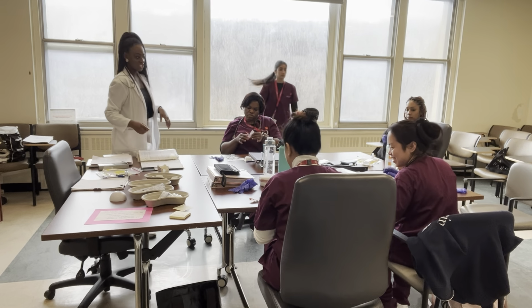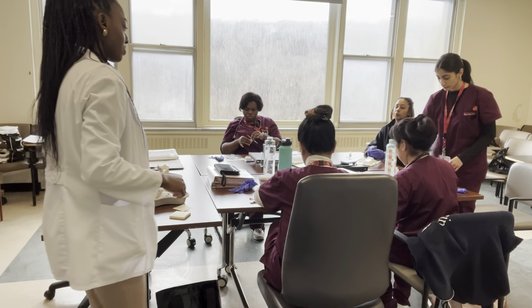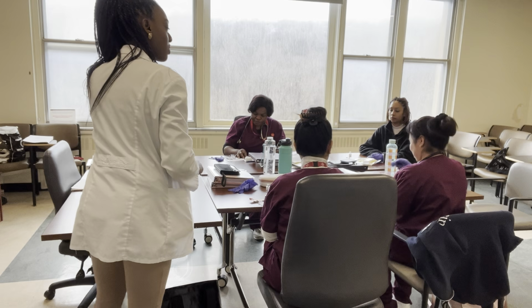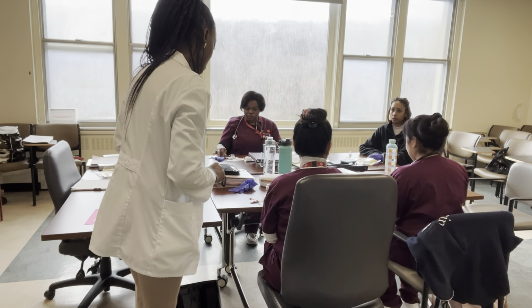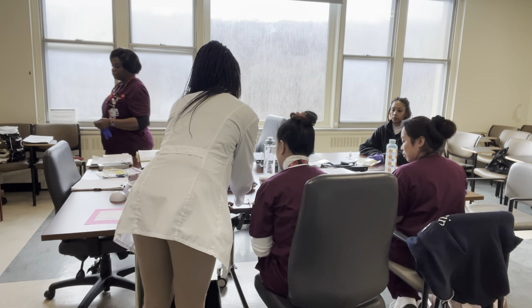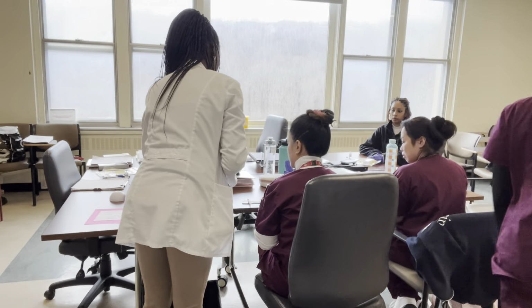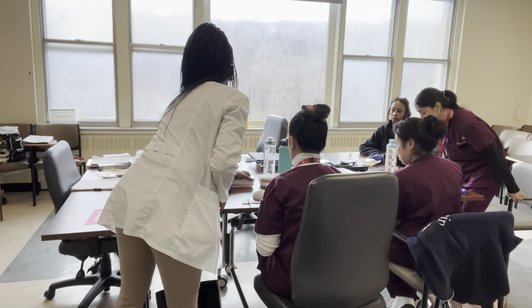So now you're going into your patients. Everybody's ready to go into patients? You can restart the process. When you're ready, you can restart the process. There's a syringe here for you. Okay. So this one, you did great. You have patient's information. Now you're going to inject into your, I don't know what it is. Patient's abdomen, you can borrow mine.